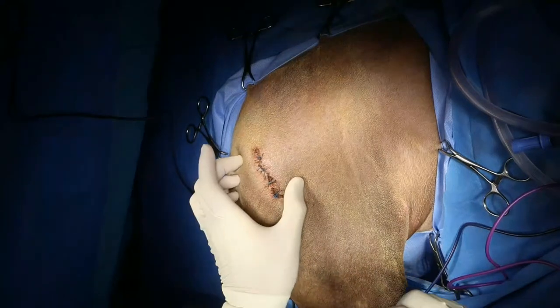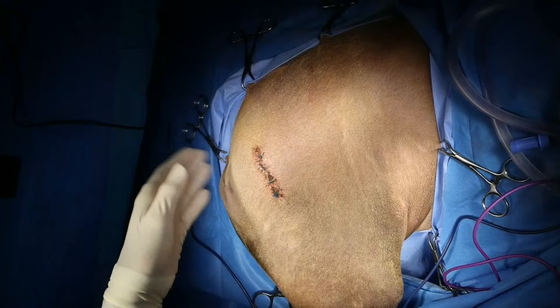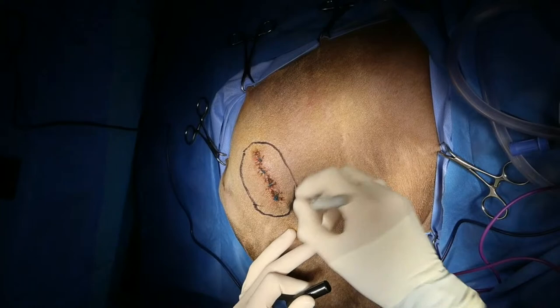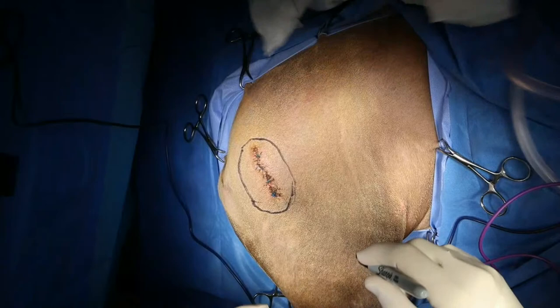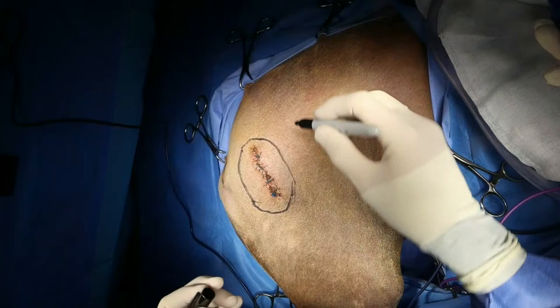This is a 6-year-old Rhodesian Ridgeback with a mass in the proximal femur on the right-hand side, just to get you oriented. This is dorsal, that's the stifle down there, that's the caudal aspect, and that's cranial up here. Biopsy performed previously was consistent with either a chondroblastic osteosarcoma or a chondrosarcoma. And so we did a CT scan, and it does appear that the soft tissue component of the mass appears to be attached to the pelvis. And so we are going to do a hemipelvectomy instead of an amputation.